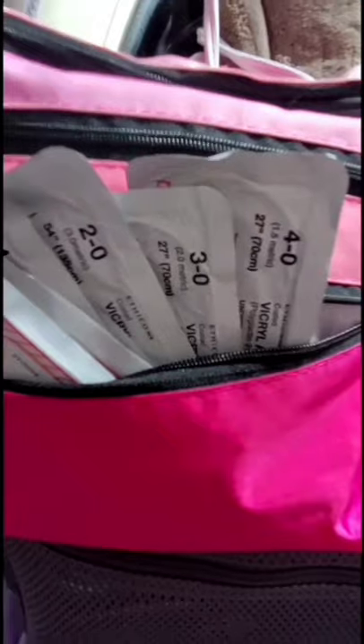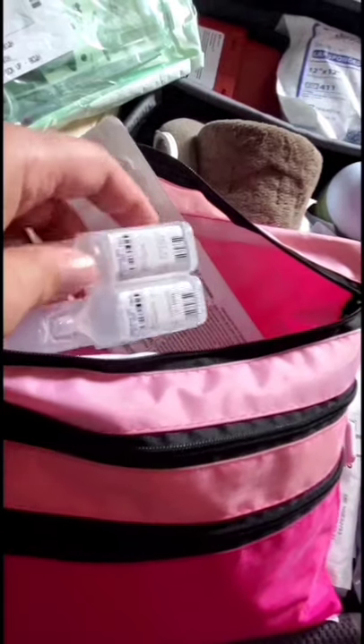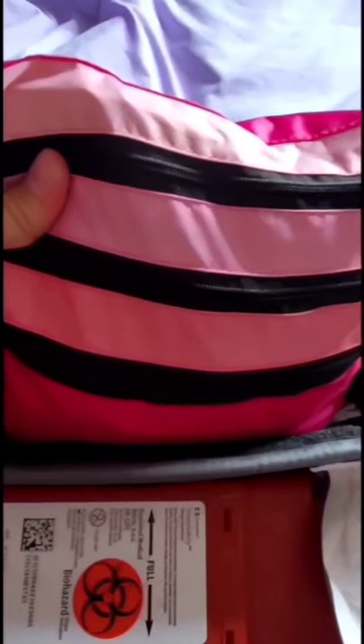I also keep 2-0 and 3-0 suture. In the second zipper I've got all my syringes and needles for adult and baby — for administering medications and infiltrating lidocaine. The top zipper fits my suture instruments as well as my lidocaine. I have lidocaine gel underneath, and I carry one percent and two percent lidocaine in this pouch. It's quite deep so you can fit everything in.